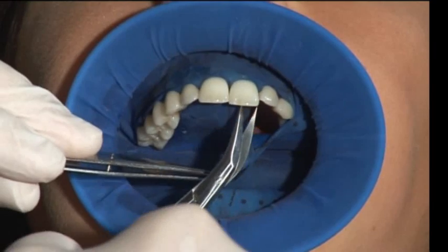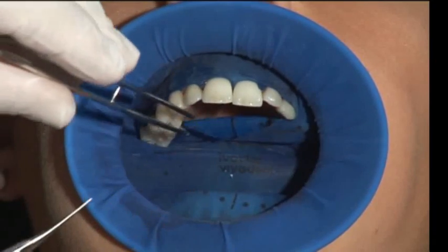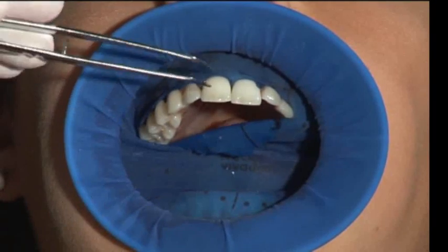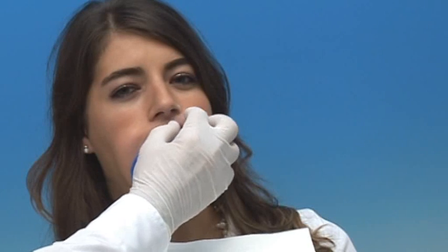For easy removal of the Optredam, pull the interdental septa with the forceps in a lingual direction out of the interdental space and cut them with scissors. To remove the Optredam, slowly pull the extraoral ring outwards until you can get hold of the intraoral ring and easily compress it horizontally. This facilitates subsequent removal.